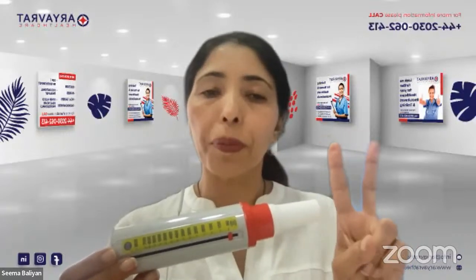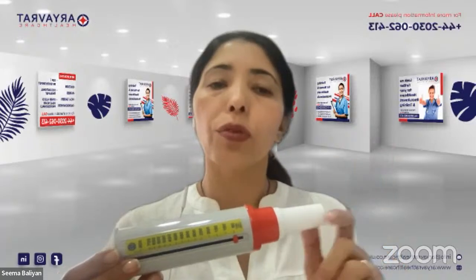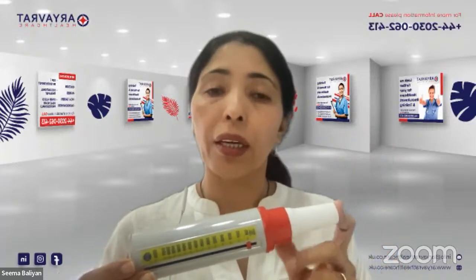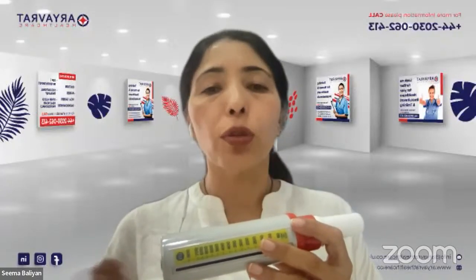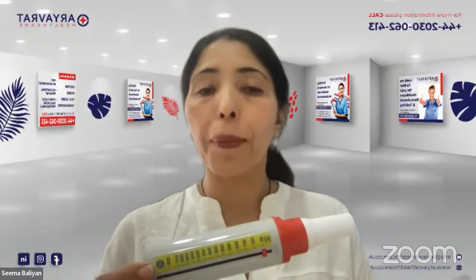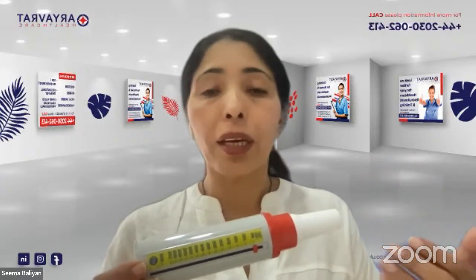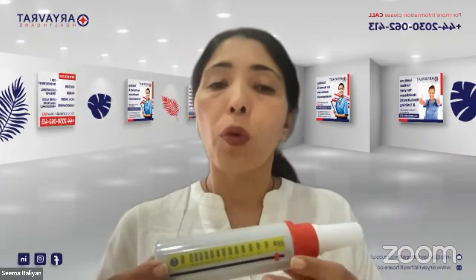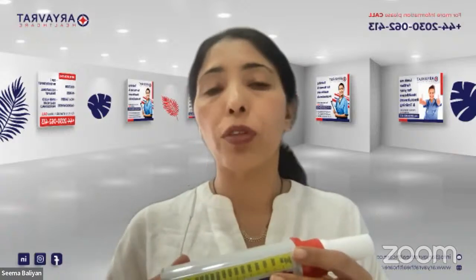So these are the two purposes: one, to measure the lung capacity, and second, to know whether the inhalers are working. Both of these things are interrelated, because if the peak flow or lung capacity is high, then that means that the inhalers are working, because the more congested your lungs are, the less your peak flow is going to be.